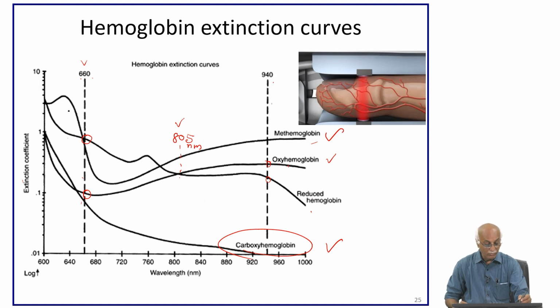Based on some estimates, of course simple algebraic calculations, we found that one more wavelength in the region between 620 to 640 nanometer, if we have it to capture this information, will help us derive all the 3 parameters from these saturation measurements. So, 3 wavelengths, not 2, but 3 wavelengths. So, that is one aspect.